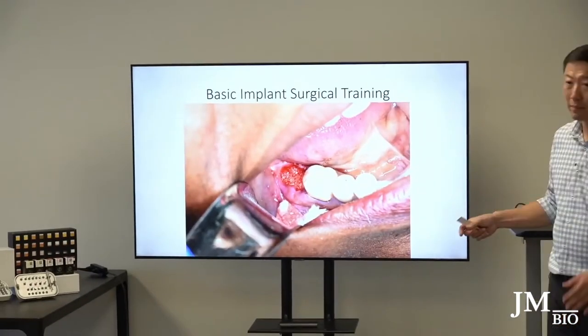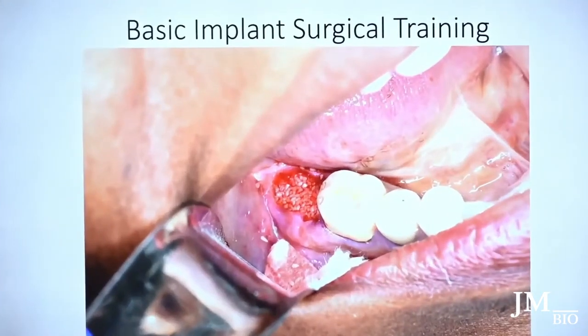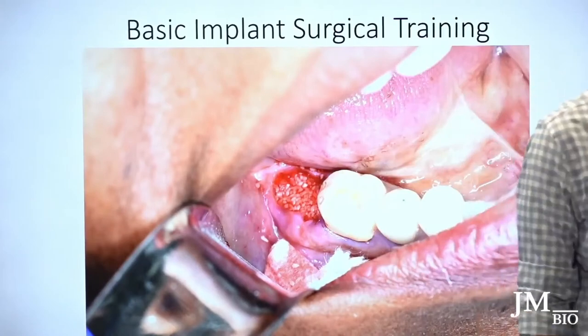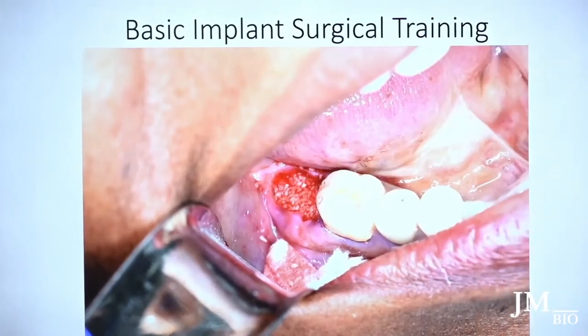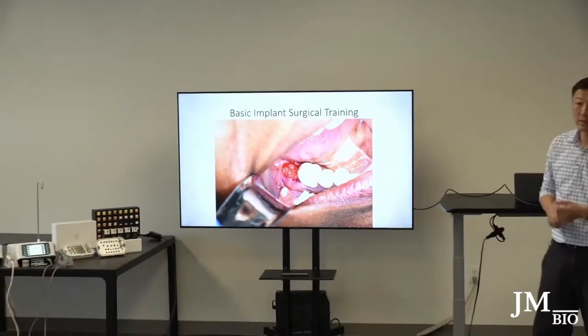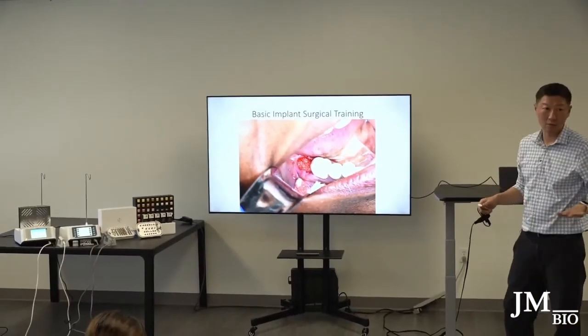It's nicely packed. I pack to the level of the crest — you don't want to over-pack or under-pack. You don't want bone on top of the gums or too much gum above the area, because when they heal it disrupts healing and you get bone particles embedded in the gums. You want to pack to just the buccal plate.